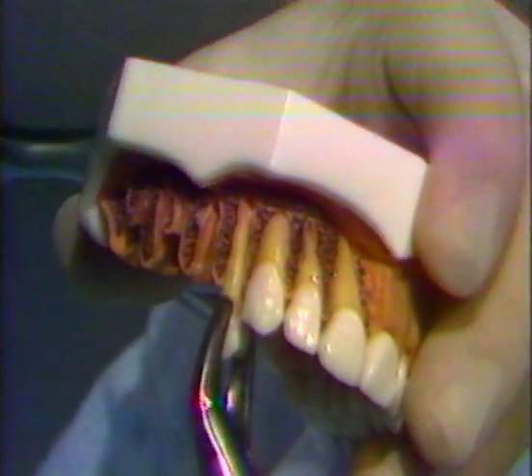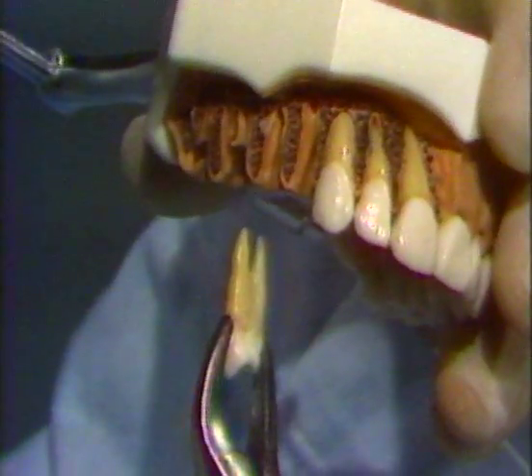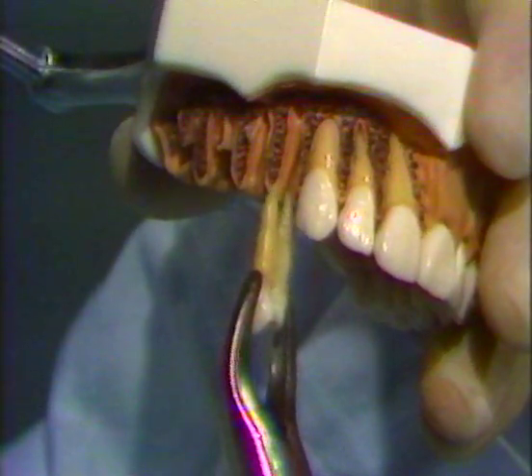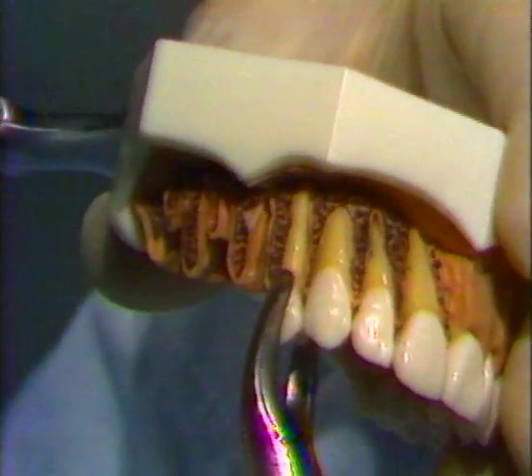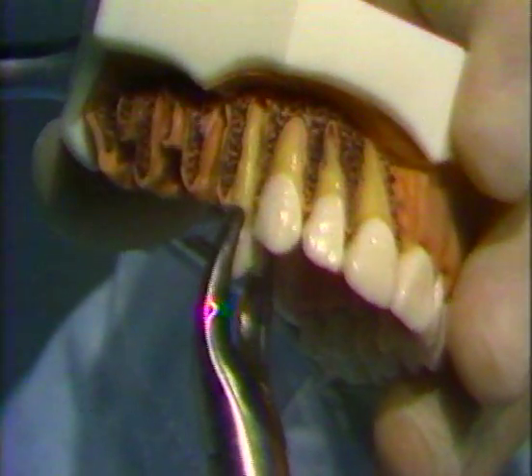At this point, it is important to note that this series of movements may need to be repeated several times before the tooth is delivered from the socket. The motions are repeated when the alveolar bone has to be expanded in order to free the tooth from its bony socket.